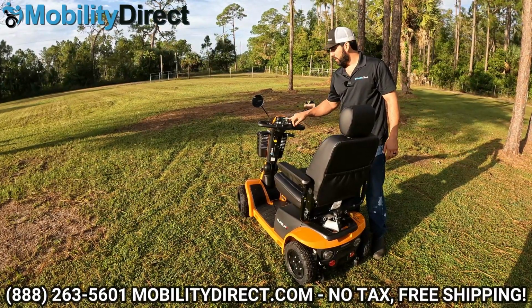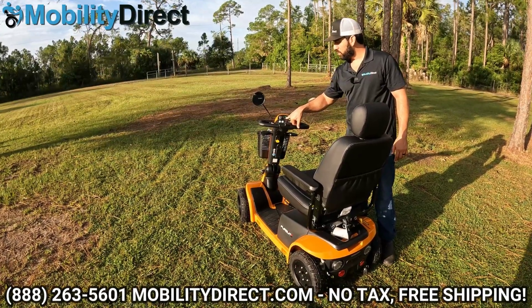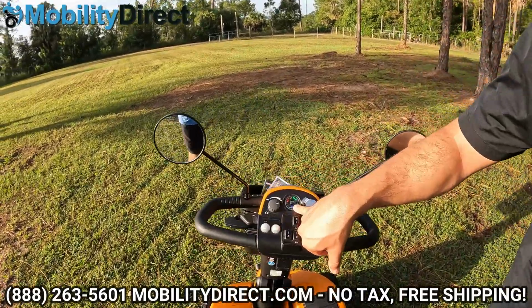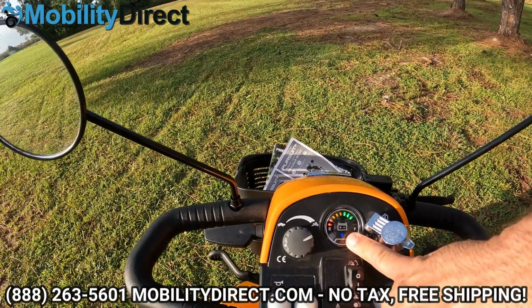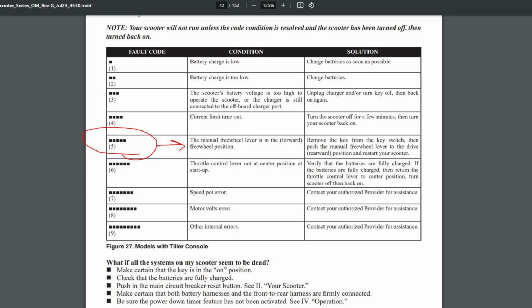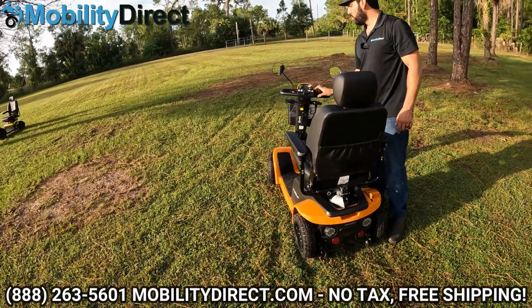There's actually a flash code sequence right now that's on the meter, which I'm going to zoom in with the camera. You can see the little power indicator light there is blinking 1, 2, 3, 4, 5 times, and then it stays solid for a few moments, and then it blinks 5 times again. If you look at your user manual, you'll see that the 5 flash code sequence means that your braking system has faulted. So you want to go ahead and take it out of neutral, put it back in drive, and now the scooter will work.